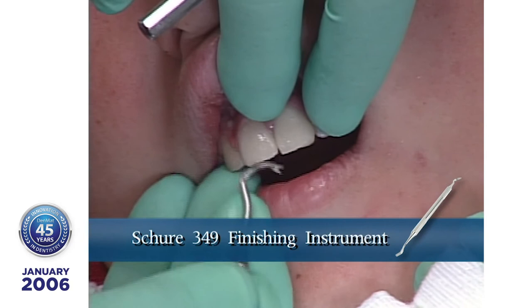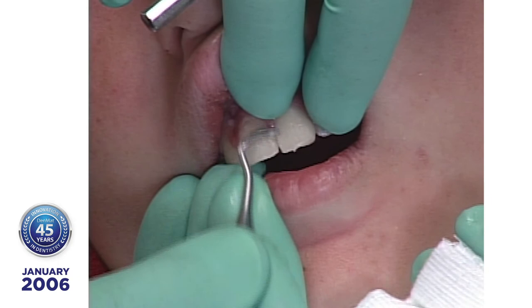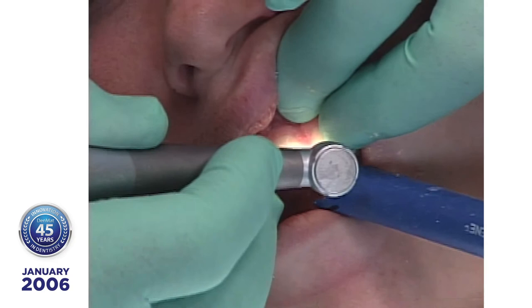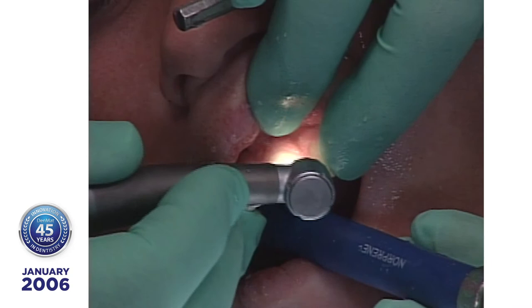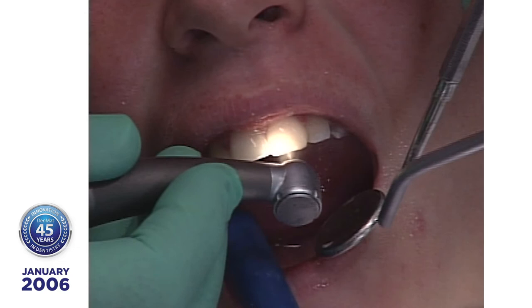The remaining excess cement adjacent to the laminate is removed using a flame-shaped 12-fluted burr. This burr will selectively remove the cured cement without damaging the glazed porcelain. All overhangs must be removed during the finishing process. The football-shaped diamond is used to feather the incisal edge into the existing tooth. Use an ultra-fine diamond to feather the gingival margins to a smooth, seamless margin.